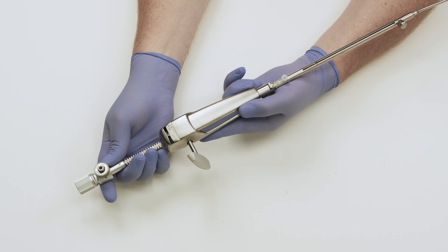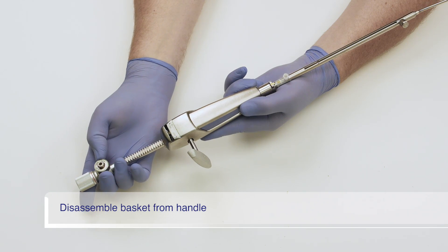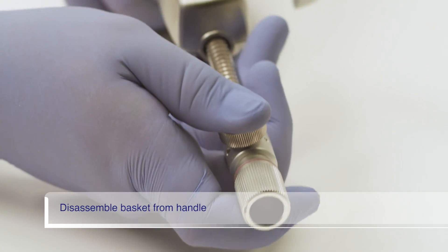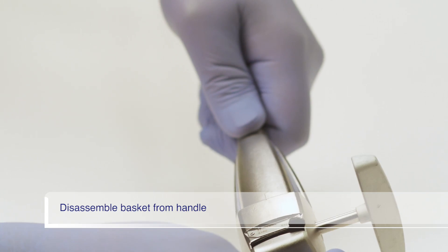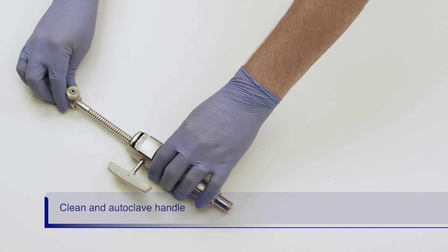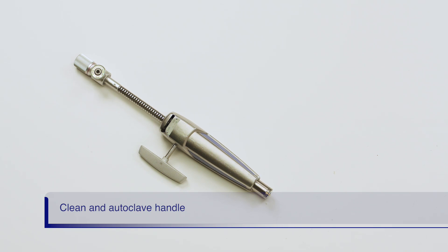Now that we are done crushing the stone, we need to disassemble the handle and basket. First, loosen the release button by turning it counter-clockwise, then push the release button and yellow button simultaneously while pulling the handle away from the basket. After the procedure, dispose of the basket. The handle is reusable and needs to be cleaned and autoclaved.